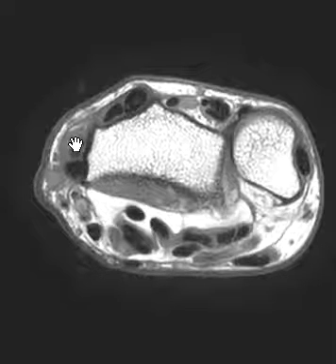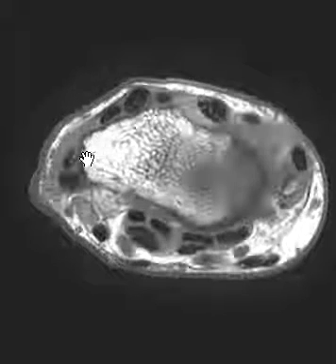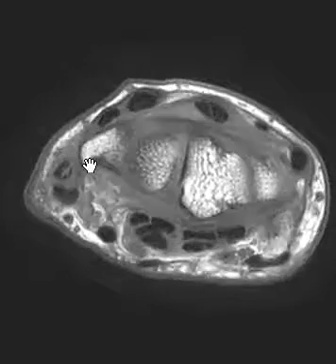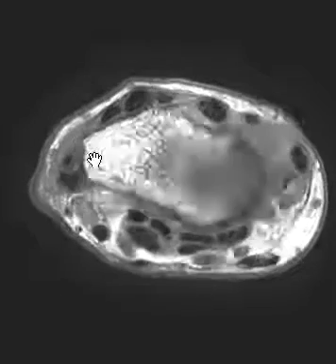But right next to it, this guy does not look quite right. This is the extensor pollicis brevis. You can see that it looks kind of flat. You see a longitudinal band of signal right within it there. It looks like a longitudinal tear between or fluid between the longitudinal fibers. We also see that it looks like there's fluid in the tendon sheath.